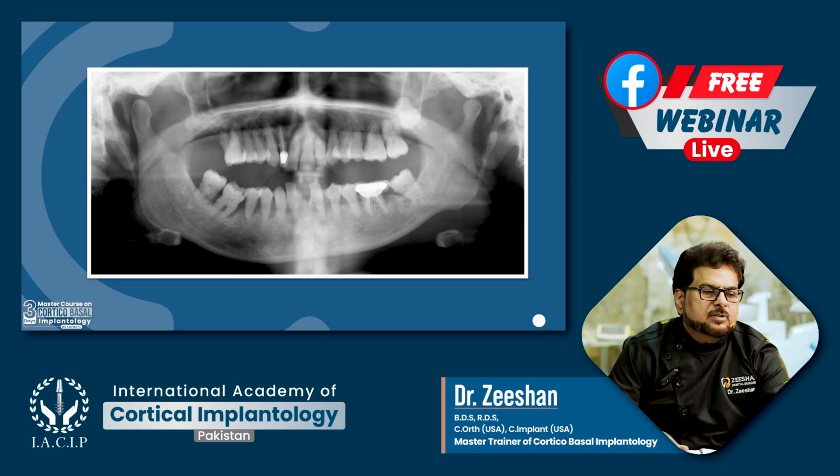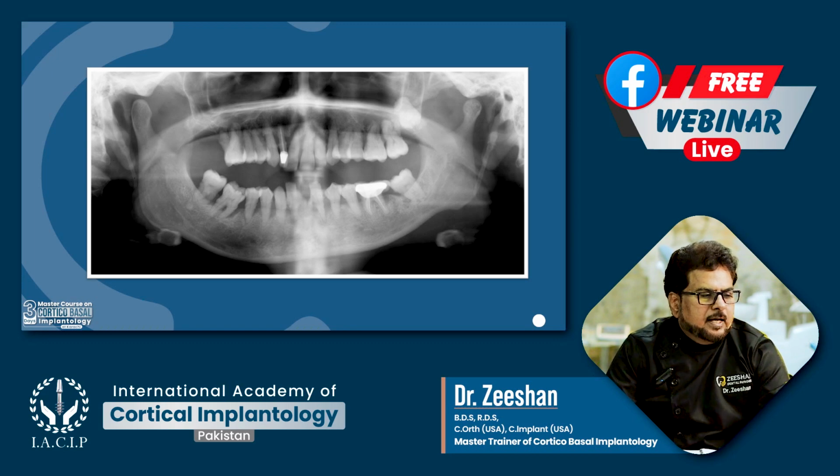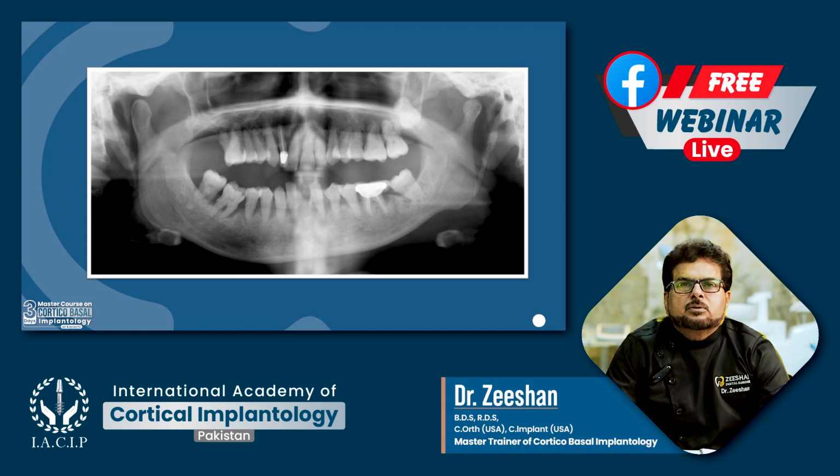But the crestal bone is not that strong. After extraction, the crestal bone is less dense in nature, exposed to infection and injuries and peri-implantitis. So all these factors don't allow us to put implants conventionally in this case, as the bone availability, quantity and quality, both are low. But as we have talked, that basal bone is always available, but it is way deeper into the jaw depth, and you have to go deeper, you have to drill higher to reach that basal bone.